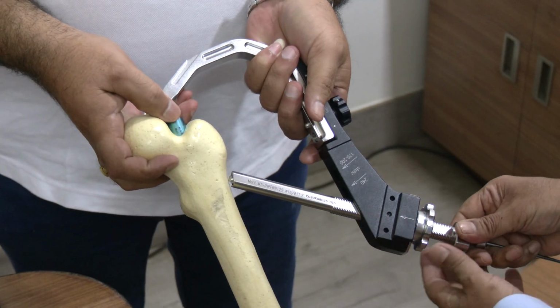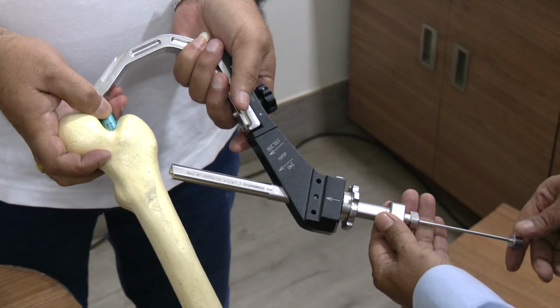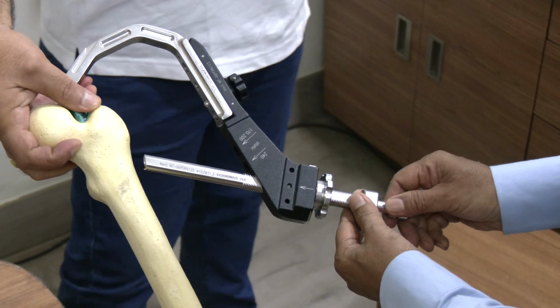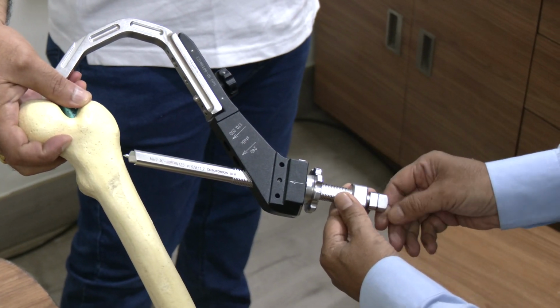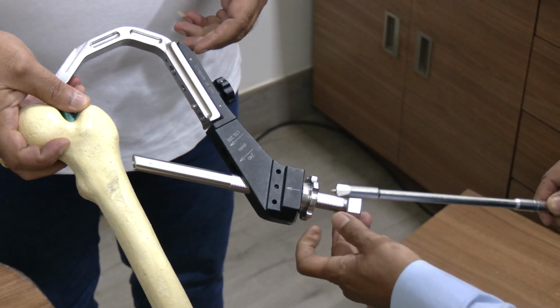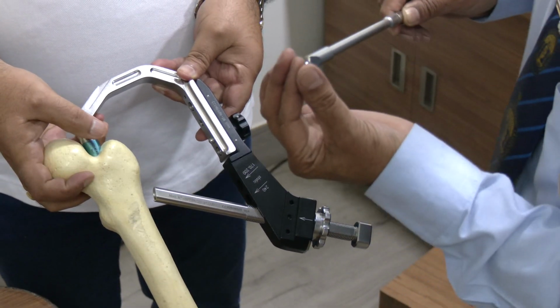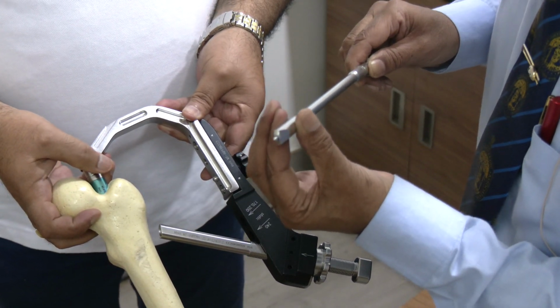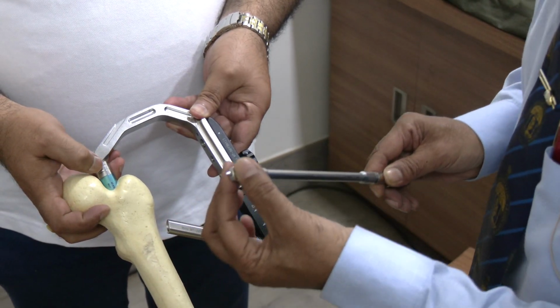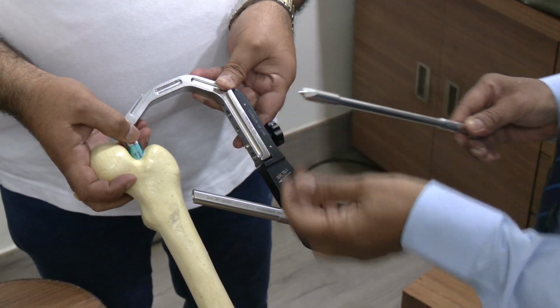Okay? Yes. That's one. And second thing is, once I have passed the guide pin, there is this proximal locking instrument or the helical locking. There are two things inside. There is a guide wire sleeve which is flat on either side. When you push it inside, it separates the muscle on either side and it goes and touches the bone. And there is a sharp trocar which makes a hole in the lateral cortex.